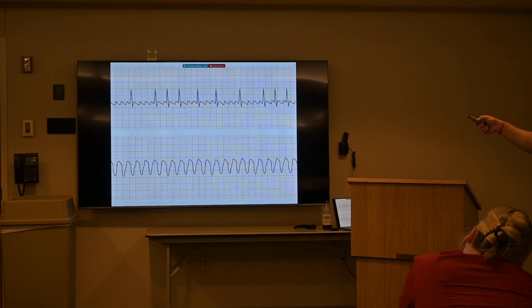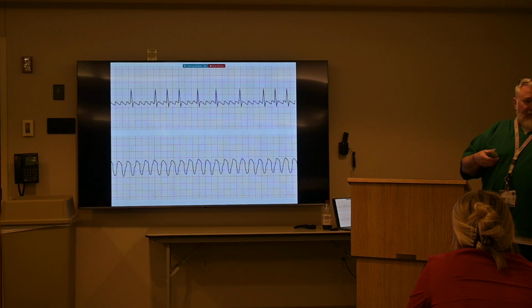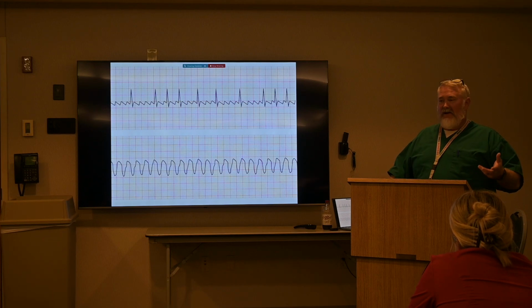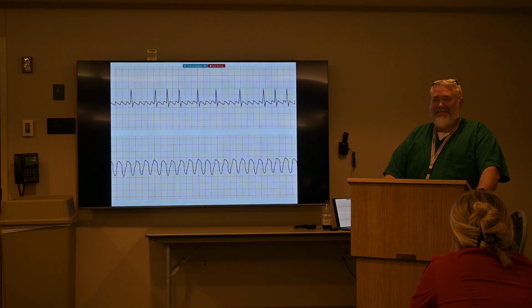Well, say you go to a patient room and you see this on the monitor, and you're assessing the patient, and they're awake, and they're talking to you, and they tell you they feel this flutter in their chest, and their blood pressure's, let's say, 100 over 70. What would you do for it based on those vital signs? Call you. Touche. Dave, I think you might want to come down here.